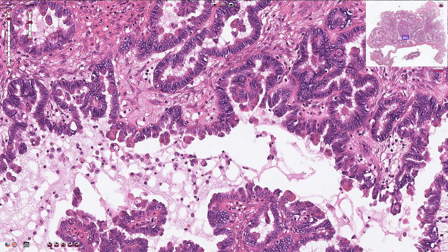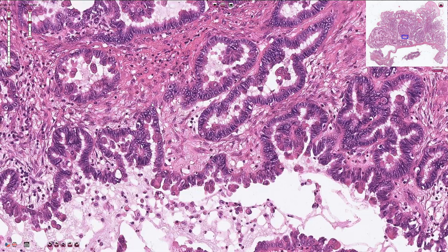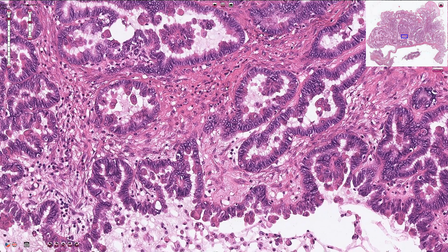The basement membrane is intact and this type of tumor is not associated with invasive type of growth. These are not invasive nests — this is just a cross-section of the papillary structures. Those nests are not associated with desmoplastic reaction.